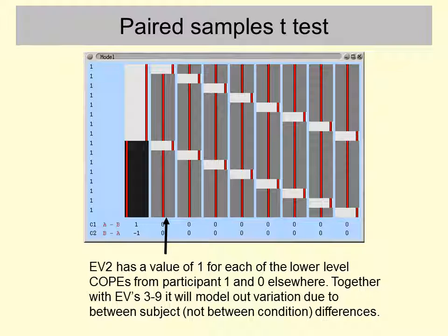And let's say participant 2 tends to have about the mean of the series for their image intensity values. You basically get parameter estimates of about 0 there. Participant 3, well, their images are a bit darker than other people's, so their overall image intensity values are lower in general, so then we get negative parameter estimates for that particular explanatory variable in order to model that out.